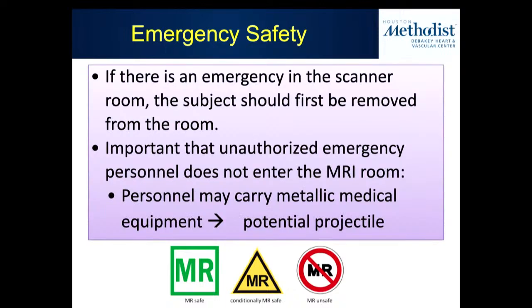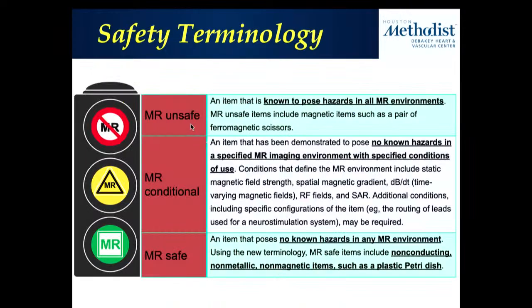Okay, so we talked about this already, which is if there's an emergency in the MRI scanner, take the patient out of the scanner room, out of the control room, put them in the holding area, which is now zone 2, and then you can meet the code team and do everything that needs to get done. Okay, the other question people always ask me is, oh, I've got a device, is it MRI safe? Well, they used to use the terms MRI safe and unsafe. That's not the terminology we use anymore. Instead, what the FDA uses now is MRI unsafe, MRI conditional, MRI safe.